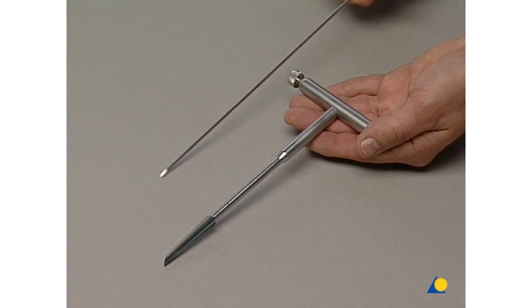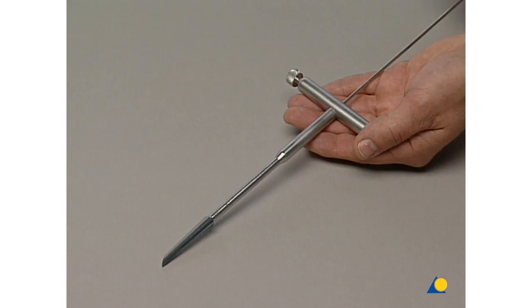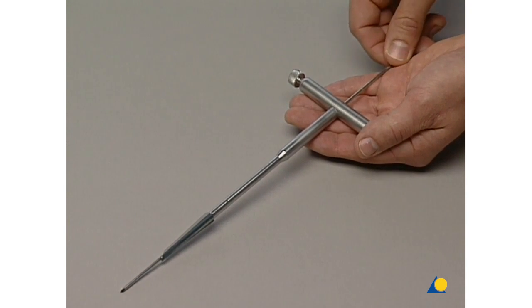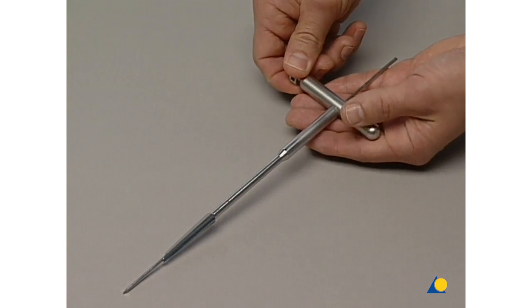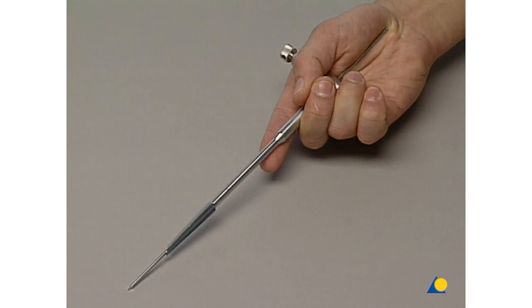Additionally, we use the cannulated awl with T-handle and a 2.5 mm Kirschner wire. We insert the Kirschner wire into the cannulated awl and tighten the screw. For your own safety, be sure to hold the instrument correctly.